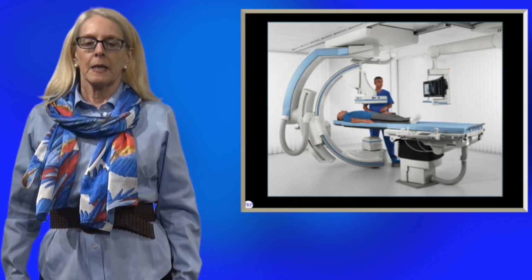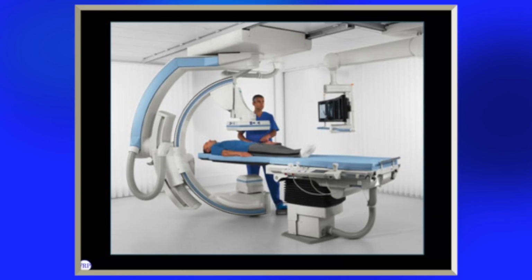This is just a look at a room. This happens to be a Siemens room. And you can see the detector on the top just over the patient is flat, and that's a flat panel detector. And you can tell also that this is an interventional or cardiac cath suite. I can't imagine it would be used for anything else. They have this flat panel detector, and above it, there's hardly anything. So you don't have the bulk that you have with the IIs. And right there you can see there's an advantage. In a lot of ways, just moving it around is a big advantage. So that's where you're going to see most of your FPDs, in the interventional suites.